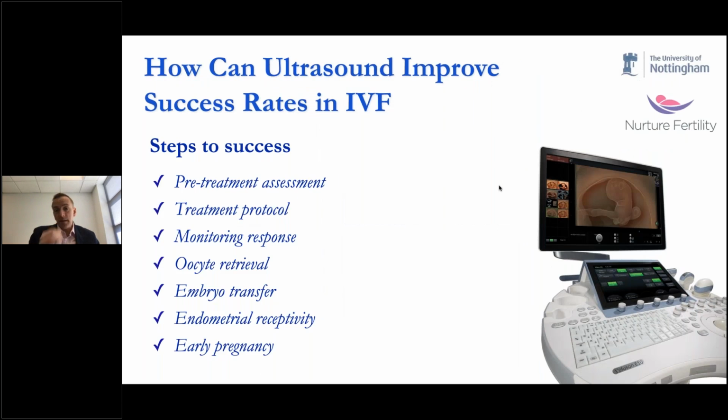Okay, I think it's taken me a little bit longer than planned, maybe just at the start. So what I wanted to do, in terms of monitoring response, let me just think a little bit about that, and then 5 more minutes, then we'll stop.